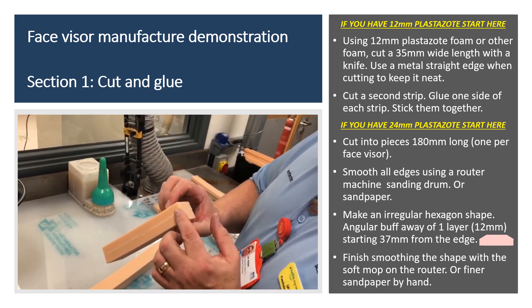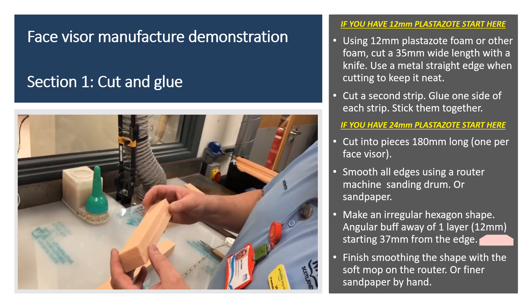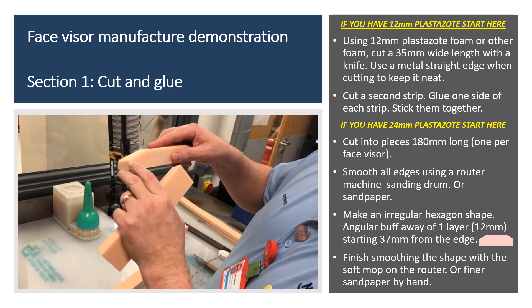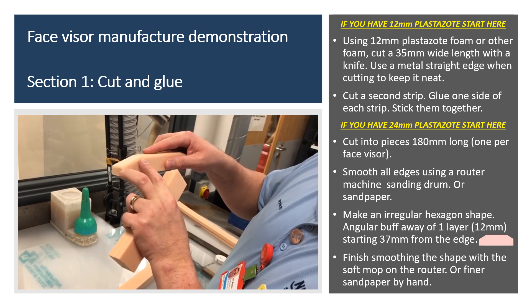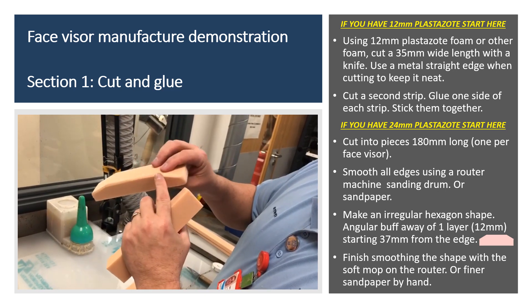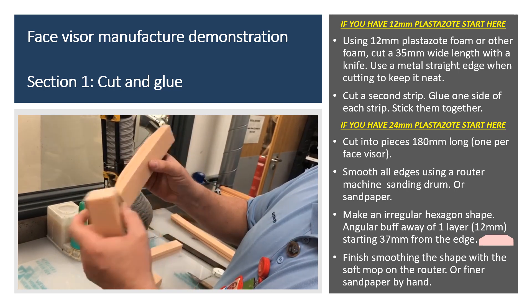Then we're going to take it next door, just buff all the edges, smooth it off, bring it down level. We've buffed down one layer, probably about an inch and a half either side. Then on your red mop, just take all the corners off, all the way around, and finish that off.